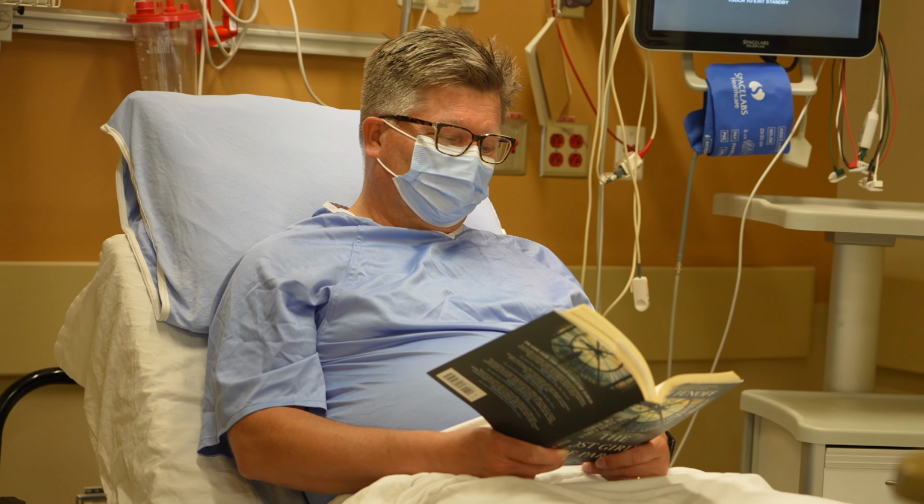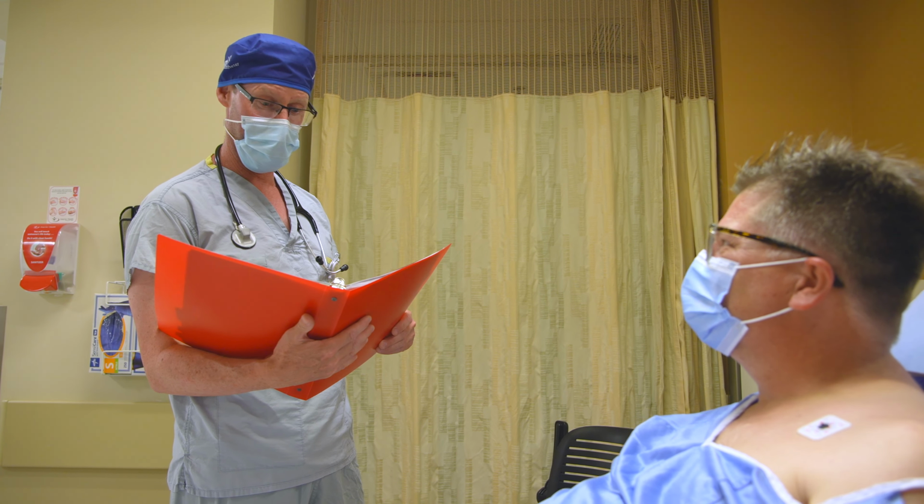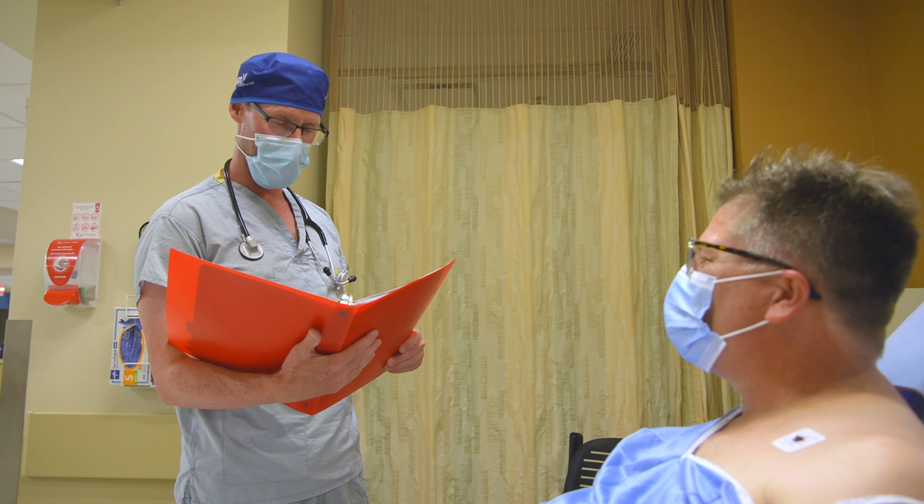The nursing staff work to get you ready when you arrive at the unit. However, there may be several patients waiting for their procedures. Everyone's angiogram is different and can vary in length from minutes to hours. This is unpredictable. Therefore, you may have to wait for some time before it's your turn. Before the procedure, you will meet the interventional cardiologist who will further explain the procedure, as well as the risks and benefits of an angiogram. The cardiologist will then make the decision about which site they will access, through your arm or through your leg.